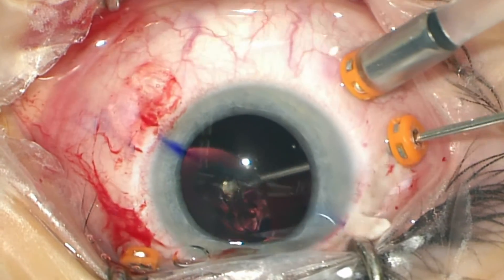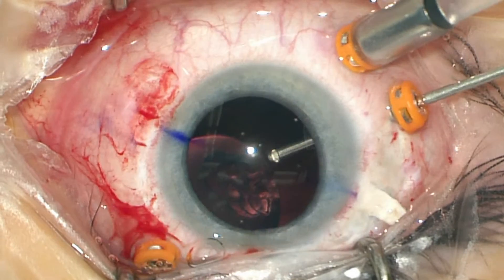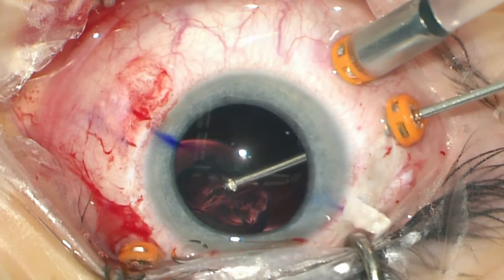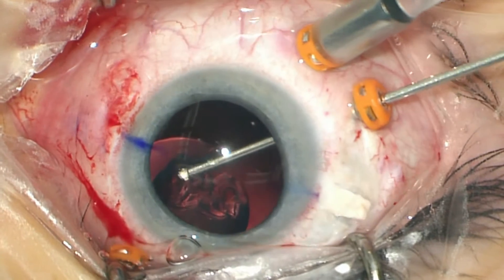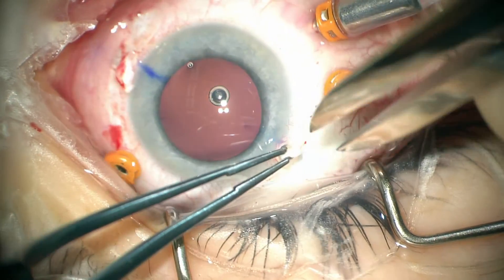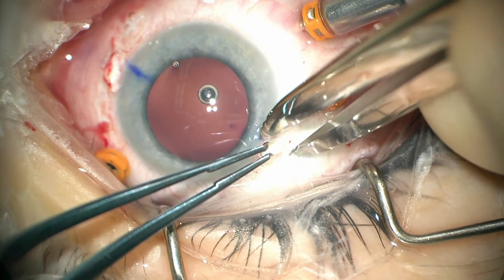We changed to this Aaron Scientific EC3 lens because the haptics are more flexible and more forgiving. We have encountered a few instances where externalizing the haptics from the Alcon MA60 lens resulted in them being bent or even broken. This new lens seems to be very easy to use.